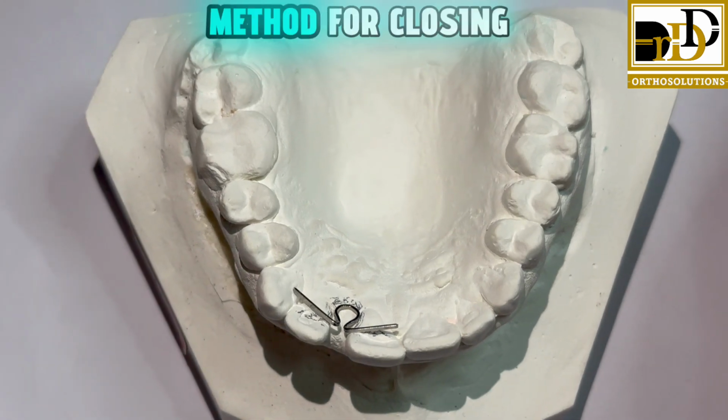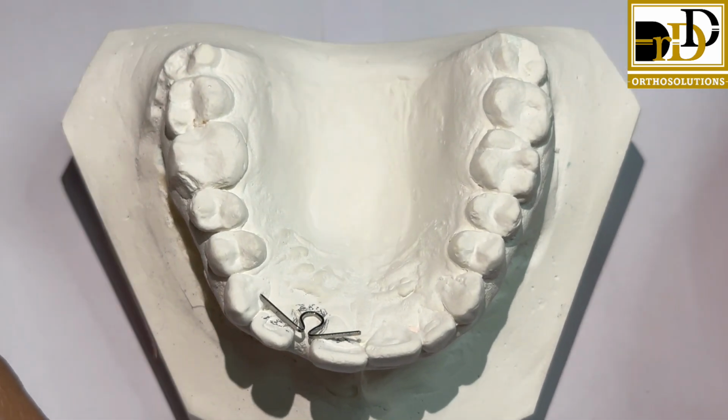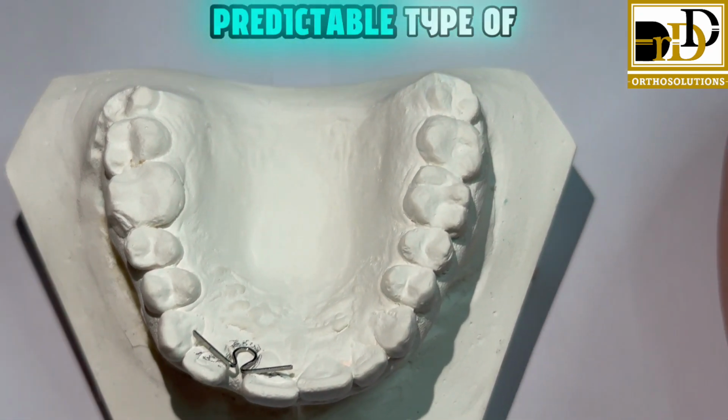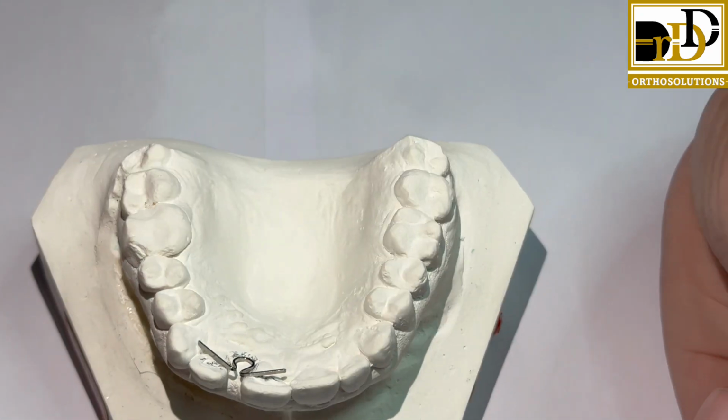This is a simple method for closing the space without much of the teeth engaging and getting a predictable type of space closure between the teeth.